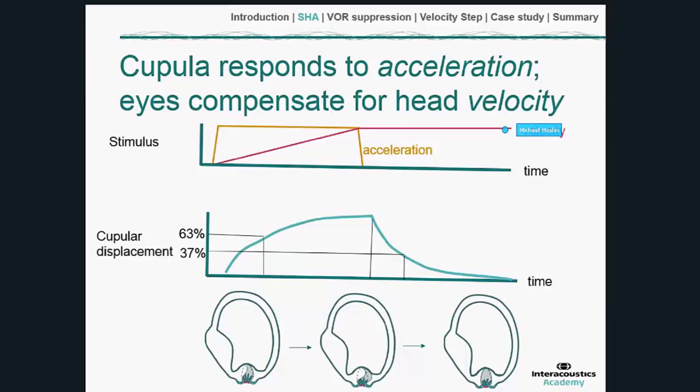And at this point, I'll just draw your attention to the yellow traces, which show the acceleration. As the velocity is increasing, we have a constant acceleration. Then when we reach the target velocity, there's no more acceleration, and the acceleration curve drops.